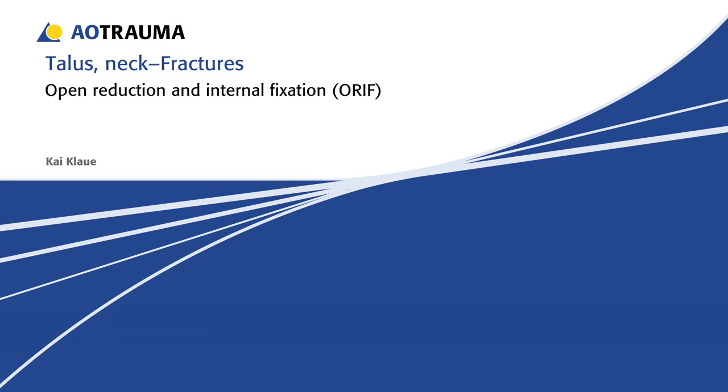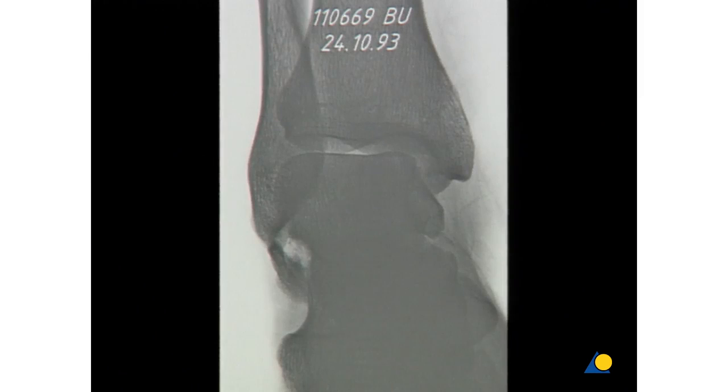Fractures of the Talus. In this exercise we will demonstrate the open reduction and internal fixation of a talus neck fracture, followed by a fracture of the lateral process of the talus.